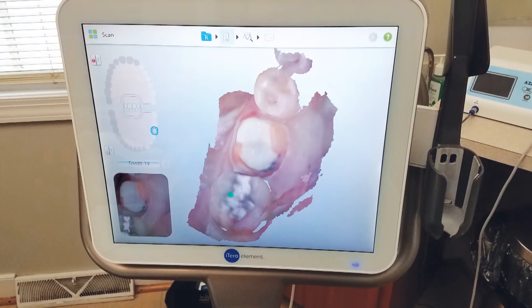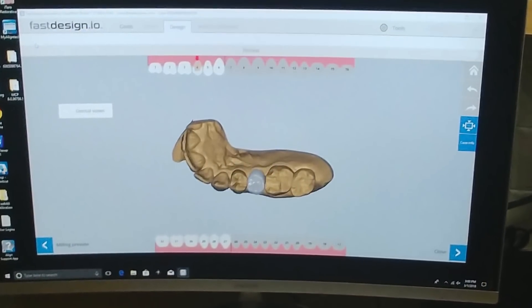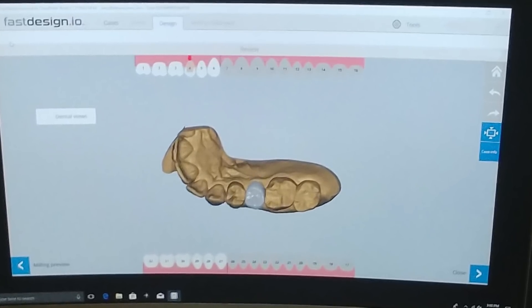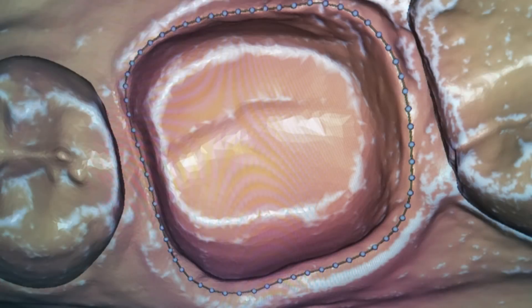After completing the digital impression, the iTero Element scanner converts the scans into a virtual model. In this case, the scan was sent to the Fast Design software, the restoration design component of the Glidewell in-office solution for processing. To begin the restoration design process, the margin was marked.